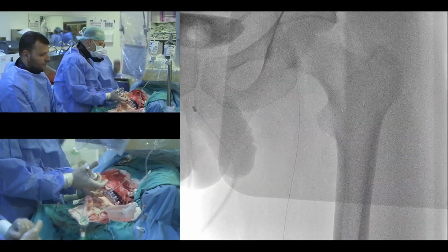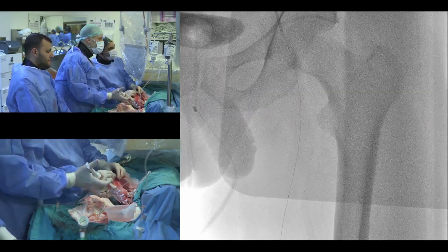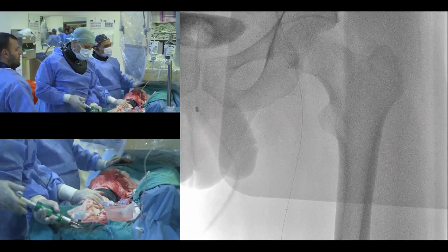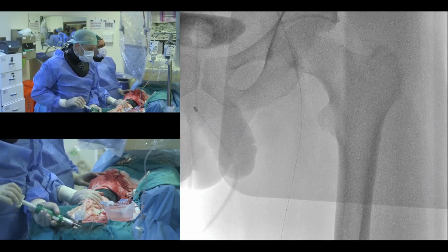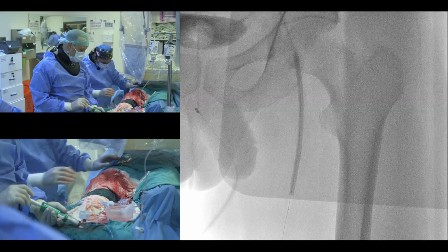The only thing different we did this time was I placed a coronary drug-coated stent in the TP trunk because I was afraid it's going to shut down again. And so I said, okay, I will place a stent. I did the same thing I had done in the past. We put him on aspirin, prasugrel, and a low-dose Xarelto 2.5 milligrams BID, which I'm using in at least 50 to 60% of my patients in PAD.